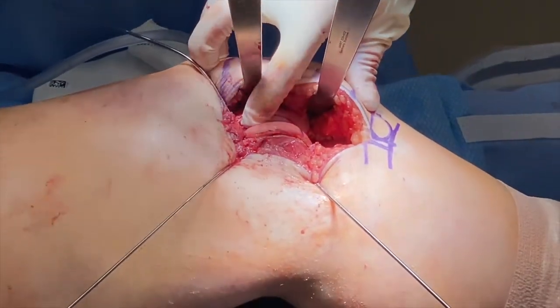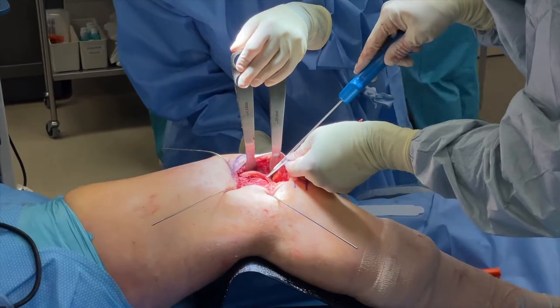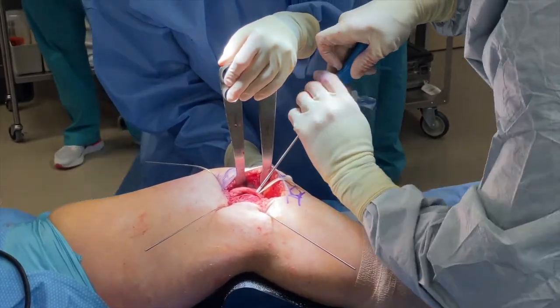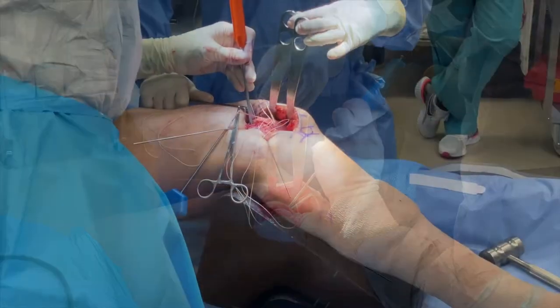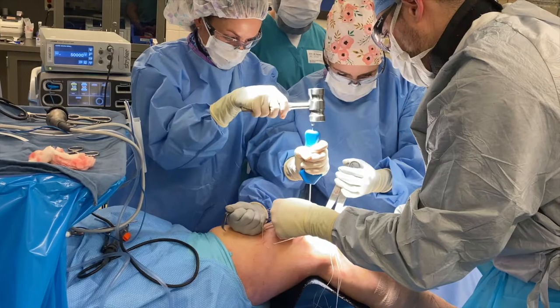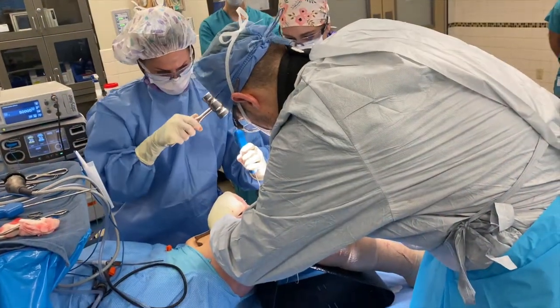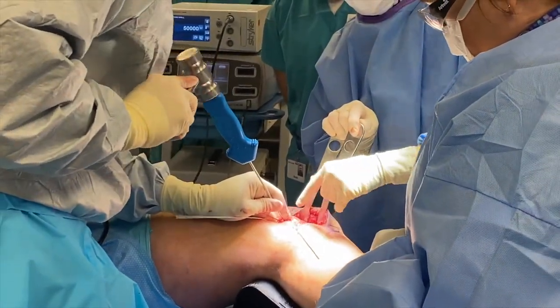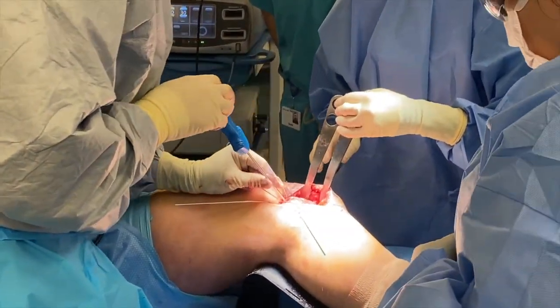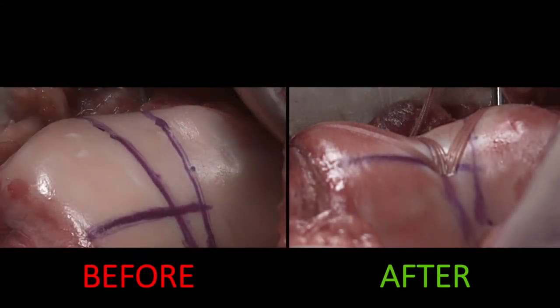We secure the flap using suture anchors placed through the cartilage and into the bone. These suture anchors are loaded with absorbable sutures, so after several months they will completely disappear, leaving a very smooth surface for the patella to slide in. Here I'm inserting the first suture anchor, then dividing and loading the sutures into additional anchors while firmly maintaining the chondral flap in the new groove. In most cases we place four suture anchors total, which does a very nice job of securing that flap to the bone. We're now essentially done with the trochleoplasty component — on the left we can see the convex surface before, and the new concavity we've created on the right.